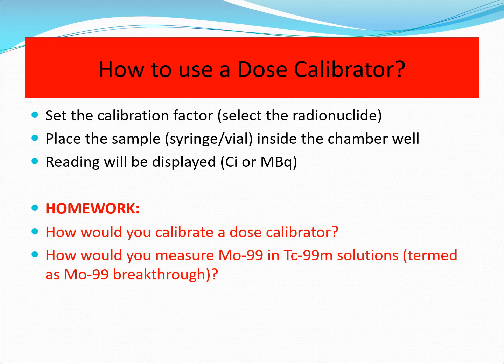How is that conducted? So the first one is how do you calibrate a dose calibrator? What are the various terms of calibration being used, and how do you do the calibration? Number two, how do you conduct molybdenum-99 breakthrough?